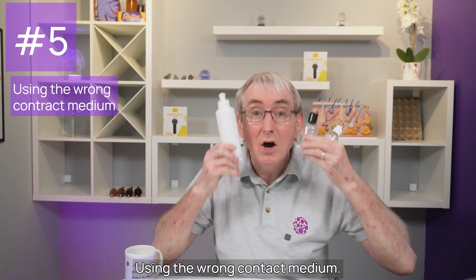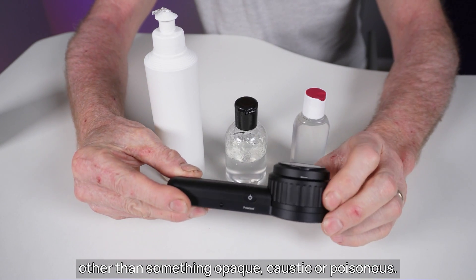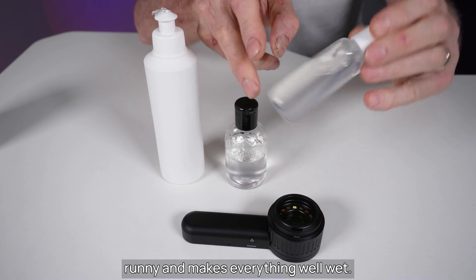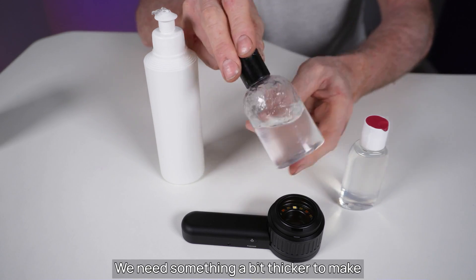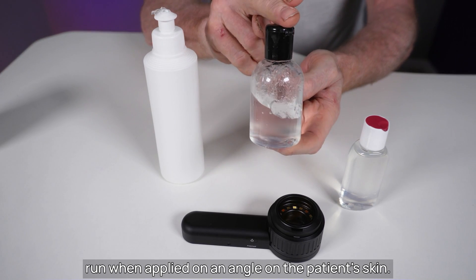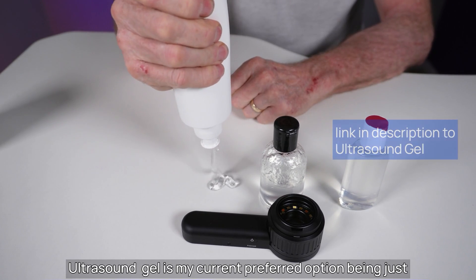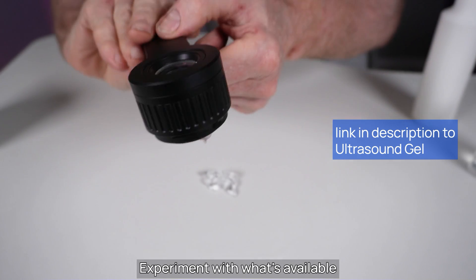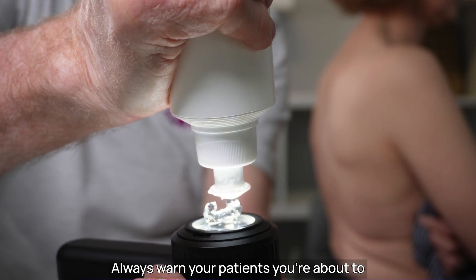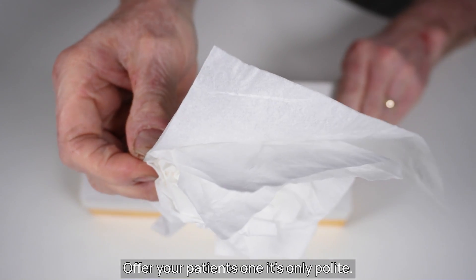Mistake number five: using the wrong contact medium. There is no truly wrong contact medium — perhaps other than something opaque, caustic or poisonous. Some people call contact dermoscopy wet dermoscopy, suggesting you can use water. The problem is water is a bit too runny. We need something thicker to make it stay in place on the patient's skin. Sanitiser gel is okay but prone to run at an angle and stings if it gets into the eye. Ultrasound gel is my current preferred option — the right consistency and designed for skin contact. Experiment with what's available locally. Always warn patients you're about to apply a gel and have tissues handy to mop up afterwards.